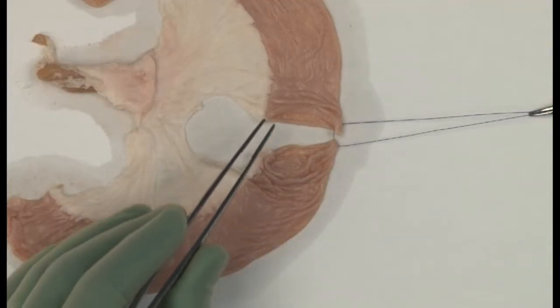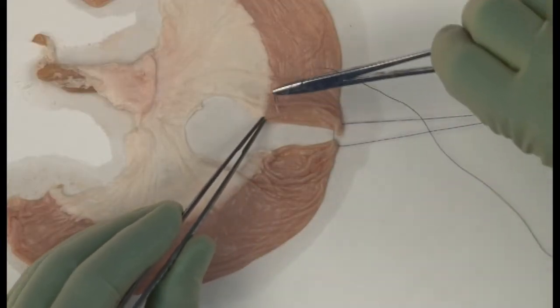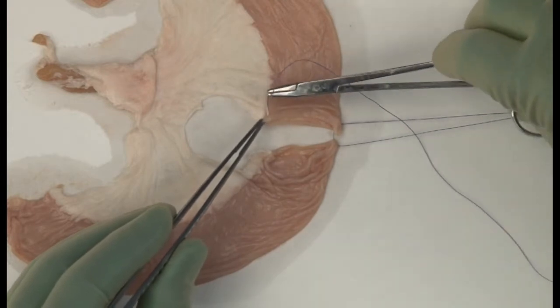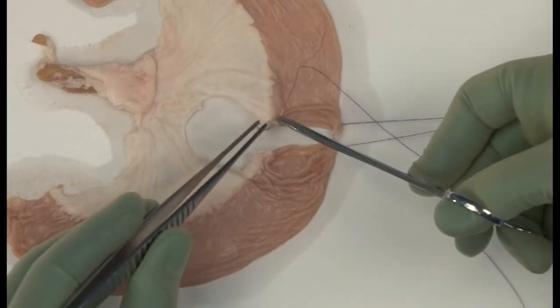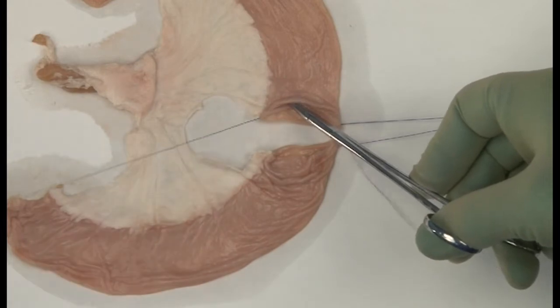Now insert a similar stay suture on the mesenteric border, pulling it through gently, and again placing it untied in a hemostat.